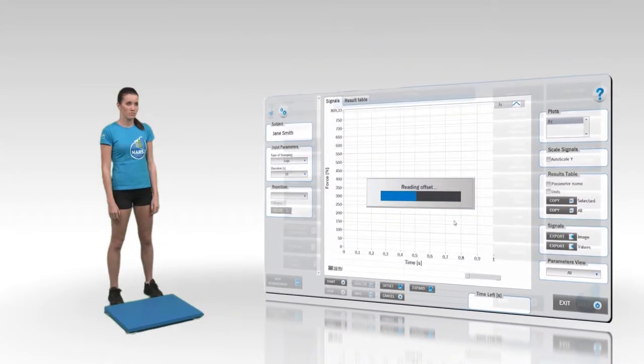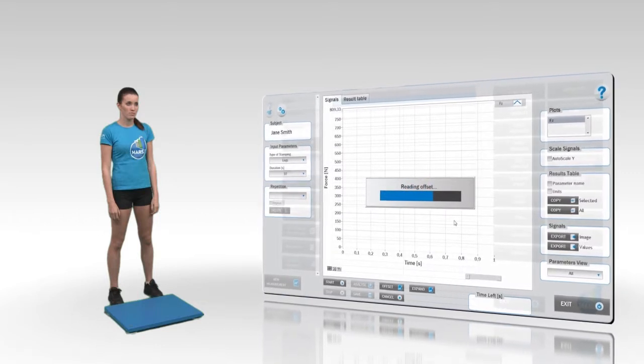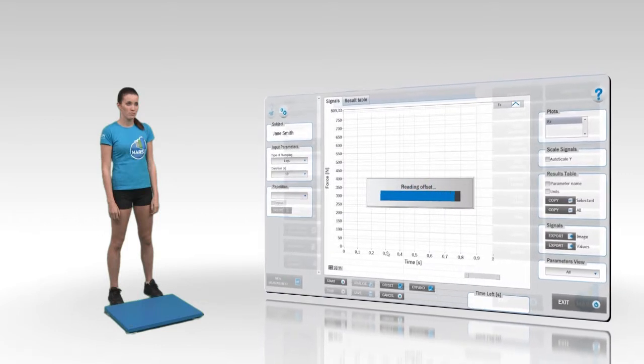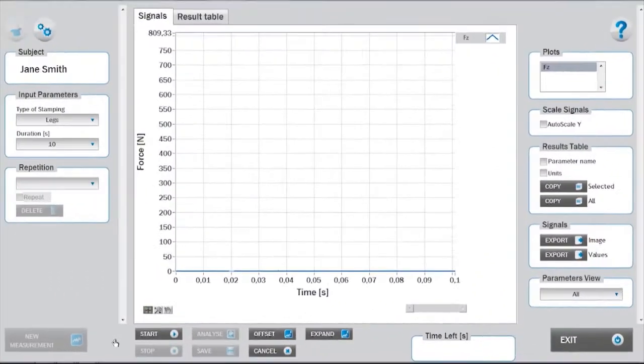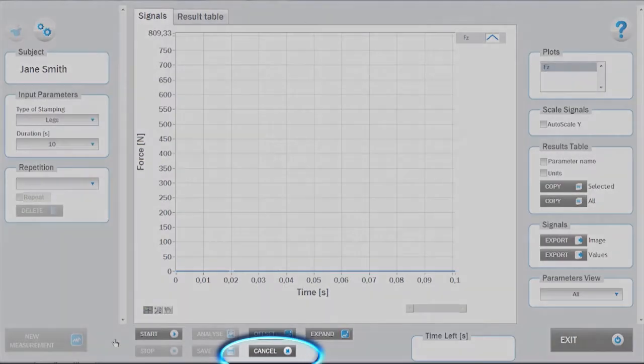During this time, the subject should not be on the force plate. If necessary, the measurement mode can be canceled by pressing the cancel button.